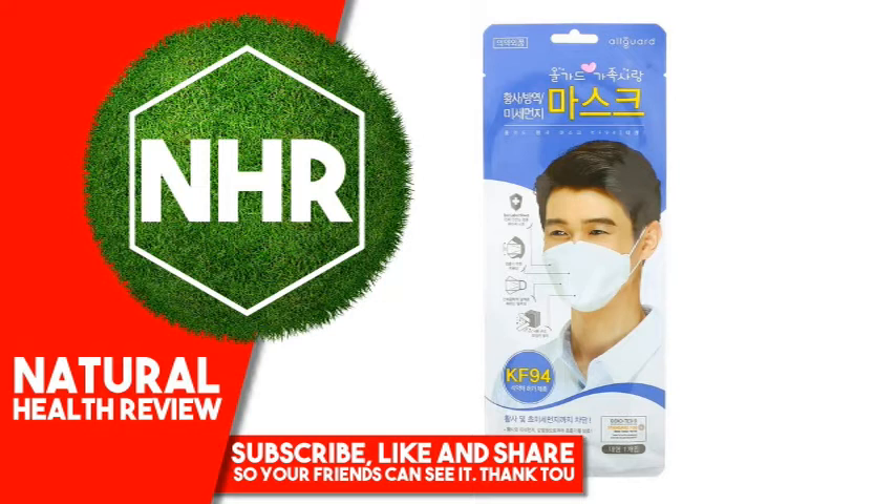This is a Korean standard respiratory protecting face piece. It is specifically designed as 3D flat fold, also referred to as fish-shaped, to provide the wearer with comfort and more space to breathe. When properly used, this product will filter at least 94% of PM2.5 airborne particles to protect the wearer from exposure to harmful air pollutants.